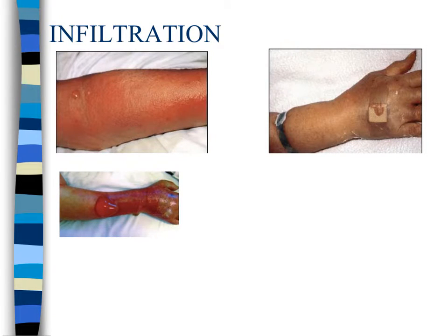Infiltration results when the infusion cannula becomes dislodged from the vein and fluids are infused into the surrounding tissues. Causes include improper placement and securement, a catheter that becomes dislodged, fragile veins, as in elderly patients, or a high PSI, so a high pressure. If it's severe, it can develop nerve and muscle damage and may lose function in the affected extremity. Blood return is not an indicator that the site is okay. The high-risk populations include neonates, chemo patients, and the comatose.